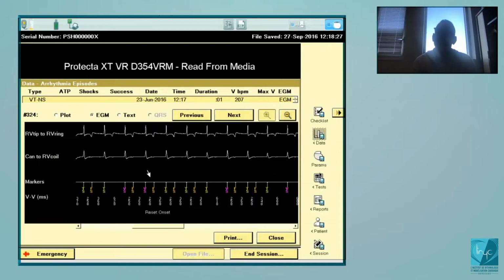What is always surprising is that when you compare the different manufacturers, there are manufacturers where they never encounter problems of T-wave oversensing. In Boston Scientific devices, it's very, very infrequent. I have seen only one case in all my life of T-wave oversensing with a Boston. It's about the same with Microport. It's very infrequent. And that's not infrequent in Medtronic and in Abbott devices. And since it's not infrequent, they have tried to find a solution to this kind of problem.